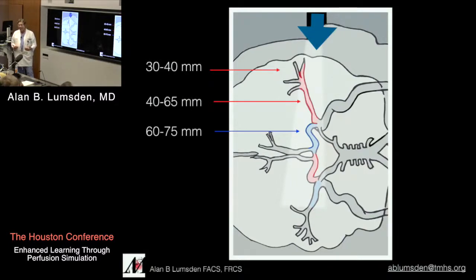We're going to have to figure out how we make this better. And I think you guys can potentially grasp this monitoring tool better than anybody else who's in that operating room, because this is what you do. And to start looking at cerebral perfusion, focus on that to start with, then you'll start figuring out the embolization. But that's a little more challenging.